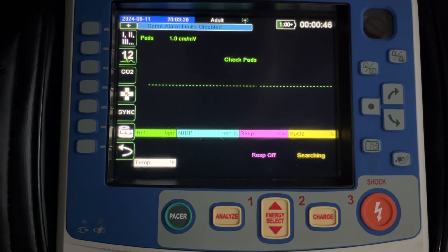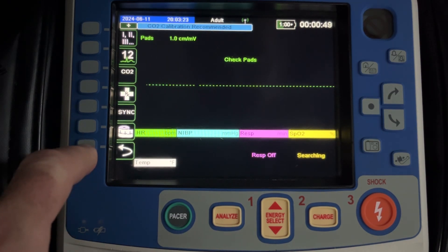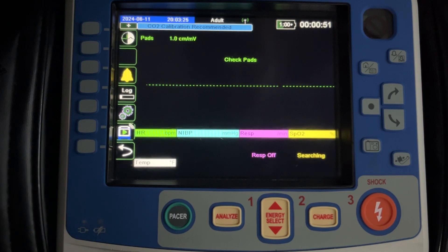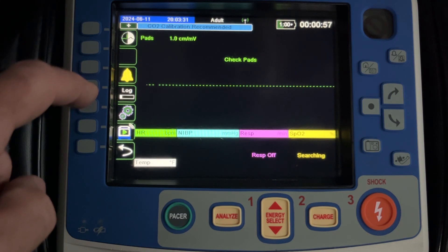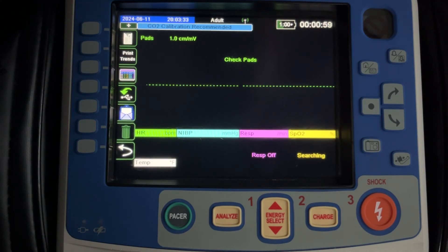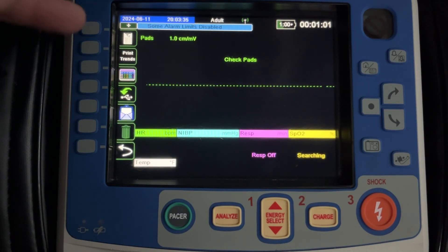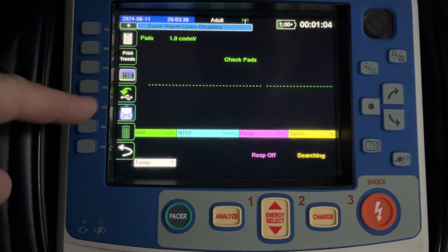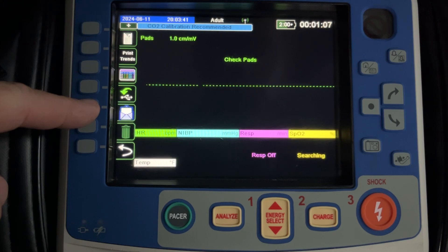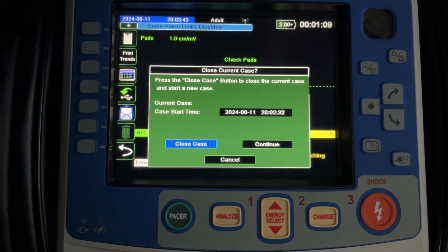So at the end of the call, you're going to press this button in the bottom left corner. That'll bring you to the second page of options. The fourth button down says Log — go ahead and press that. These would be buttons if you wanted to print, but more importantly, this white envelope right here is how you're going to send it to ImageTrend. Press that button.